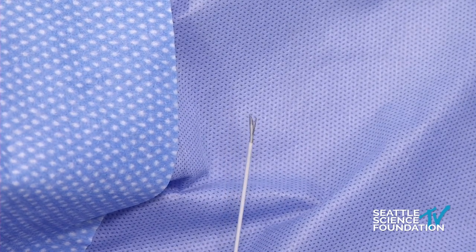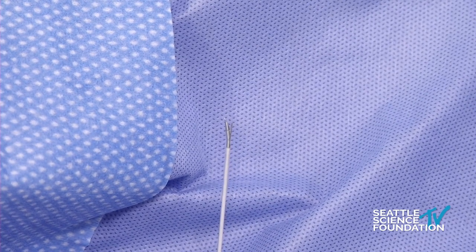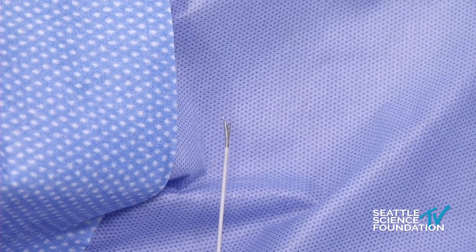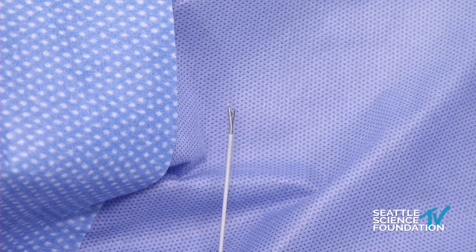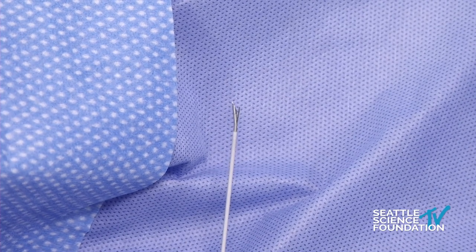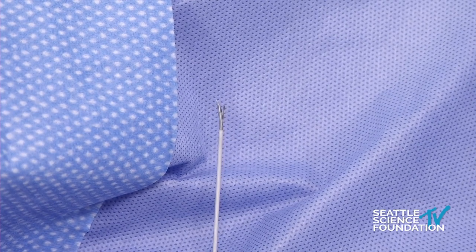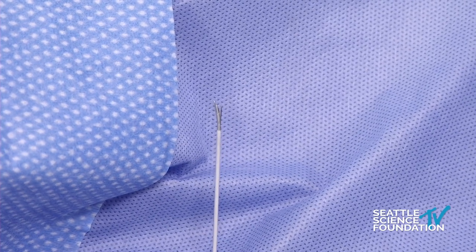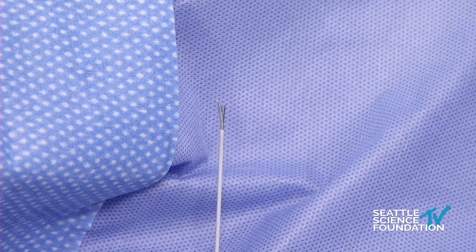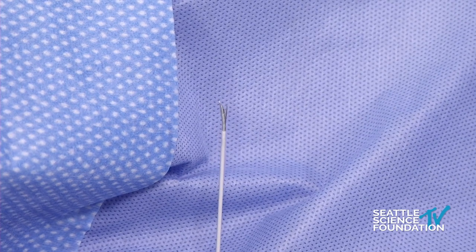So this is useful in situations, in my opinion, when you may want to deliver multiple ablations, such as in the third occipital nerve. The recommendation for ablating the third occipital nerve is that you apply 3 or greater lesions, because that nerve can span from the inferior articular process of C2 over the joint and to the area of the superior articular process of C3. So that's some serious territory to cover in order to have a good likelihood of interfering with nerve function in that space.